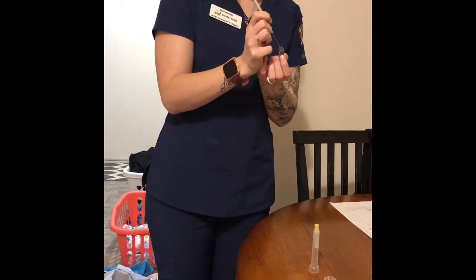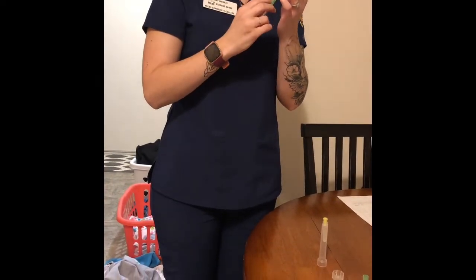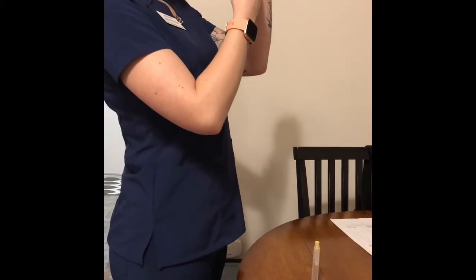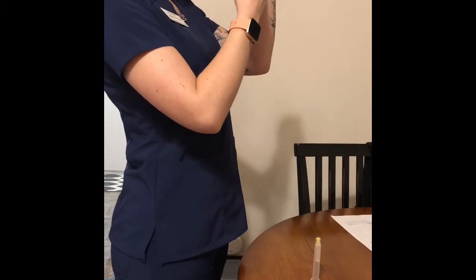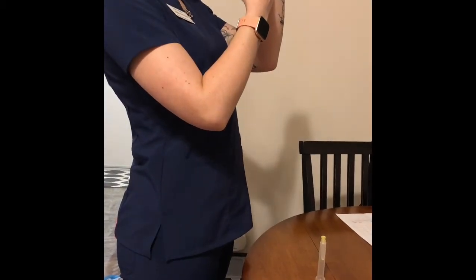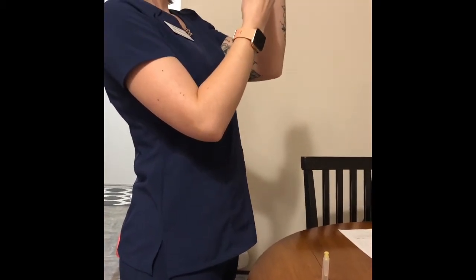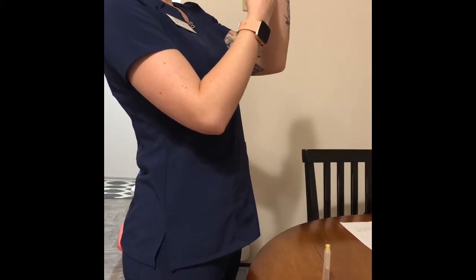You can put it in, and careful not to touch insides of anything. Keep it as sterile as possible. So we want to get out the 0.5 milliliters, and when you do that, it's also going to aspirate some air. And you want that air, so you want 0.2 milliliters of air. So you're actually just going to watch the fluid as it comes out because of that air.